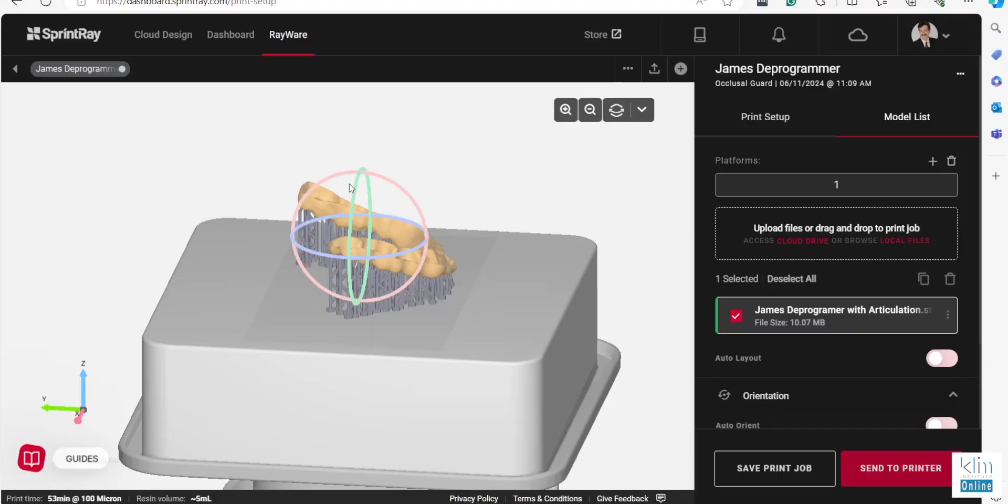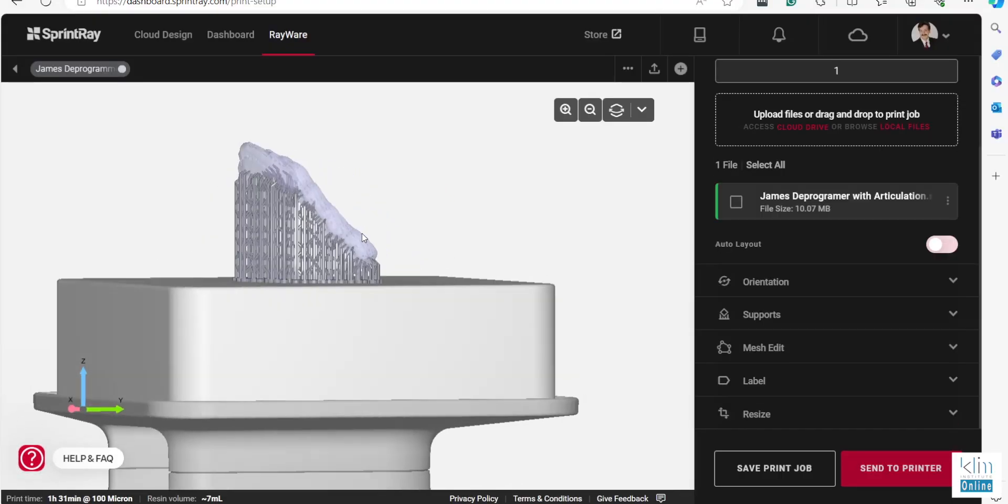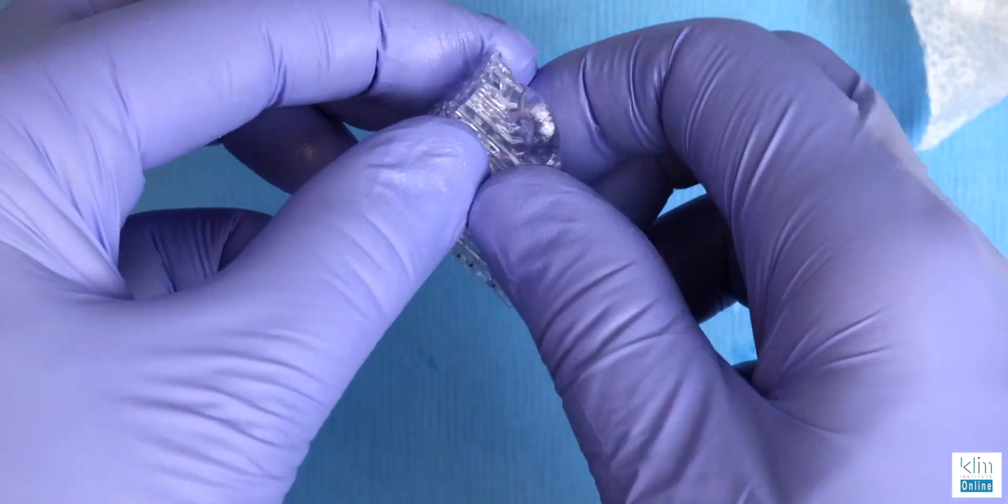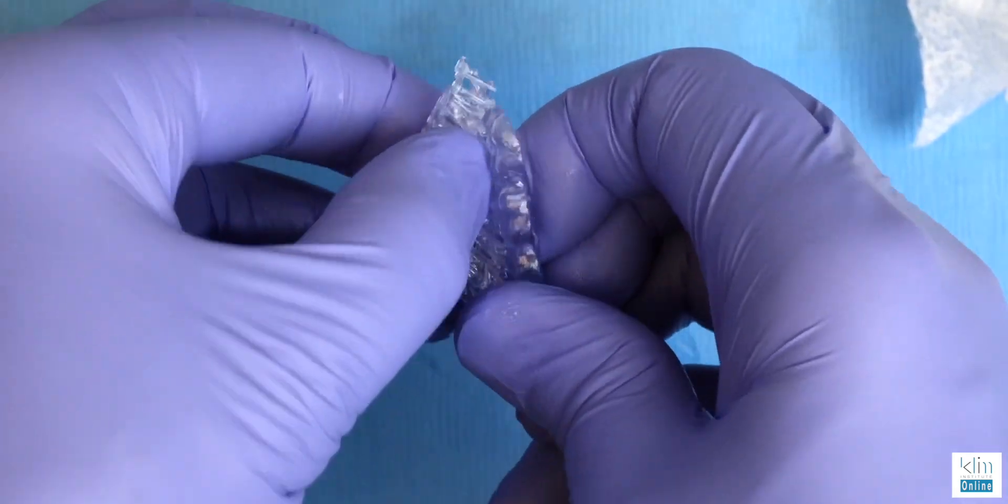Just a few comments about setting it up in the Sprint Ray software. You do have a downloadable software, but I find that at the time of this video, the supports are just a little robust and they're hard to remove. I like the Sprint Ray Cloud and their software online. We do position the splint at an angle so the supports are not on that bite platform. And with the online software at this time, it's really easy to remove those supports. Just with your finger, they pop right off. They're smaller and they're easier to clean up.